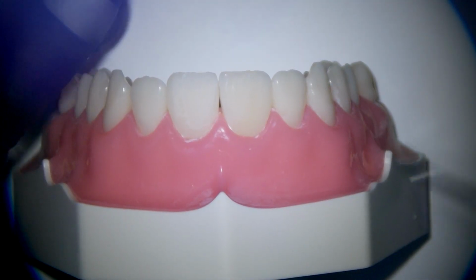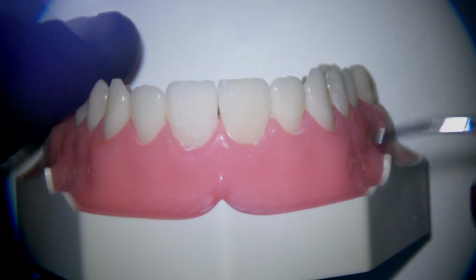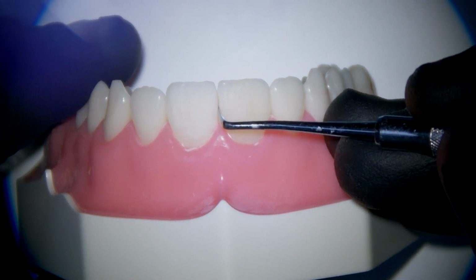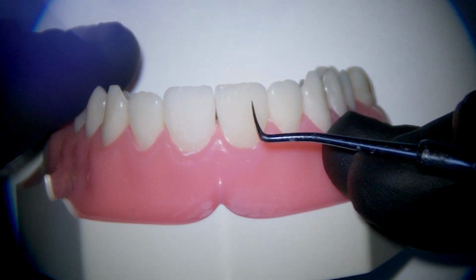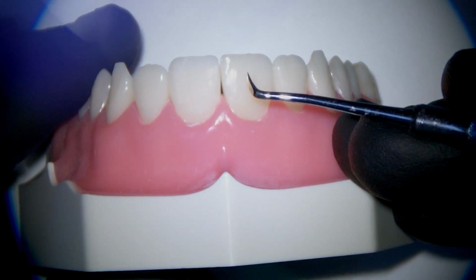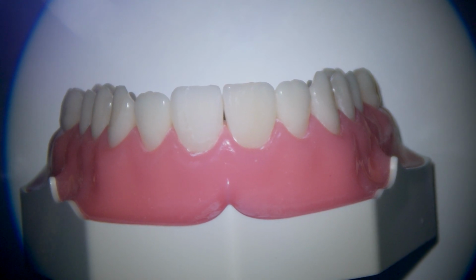So let's go ahead and do our torque, and then we're going to start cleaning up, and then start doing the first initial contouring steps. So let's take a look. All right, first thing I'm going to do is take that same instrument that I used earlier. I'm going to come in between the teeth, and I'm just going to give a little pull away, just a little torque to separate the teeth. Again, that's kind of scary, but just caution the patient, that's what's going on.